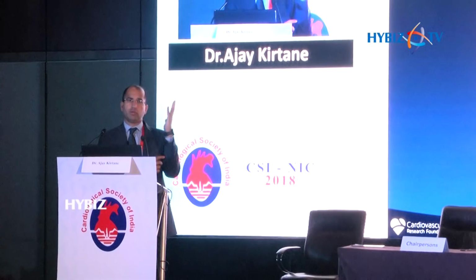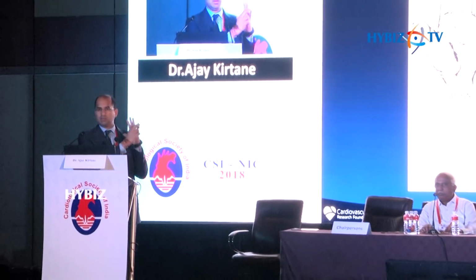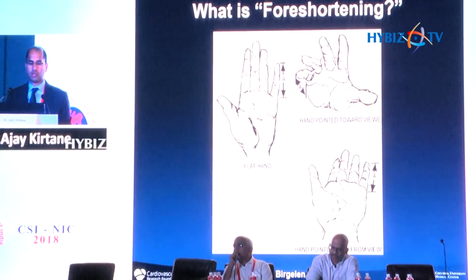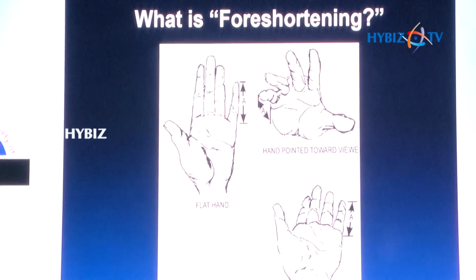It doesn't matter whether you look at it this way, or this way, the length of the pinky is the same. The thing is, if you actually change your orientation of your hand, if you turn it this way and you measure the length from here to here, if I'm looking at it this way, it's a lot shorter. Similarly, if I point away, it's a different length.